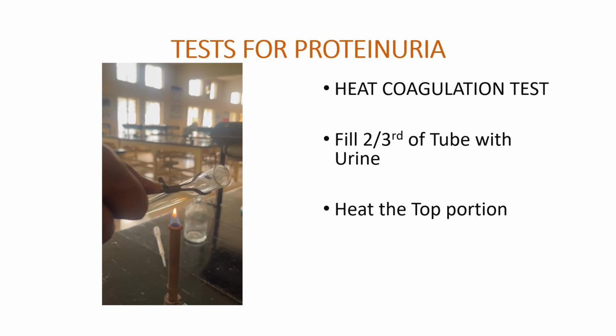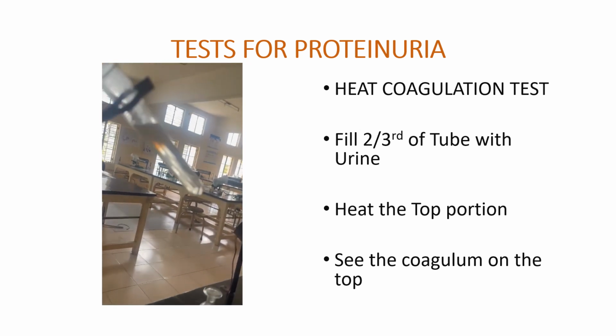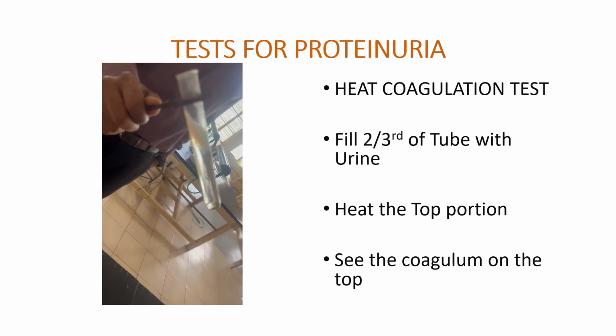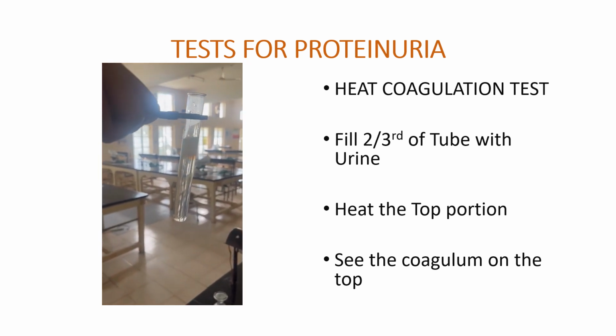I'll tell you why we only heat the top portion. Once you heat the top portion, that area will form the coagulum. Once again, I'm showing you what happens when I heat the top portion. Already I got this coagulum on the top. I'm just trying to put it into focus to show you the clear difference.